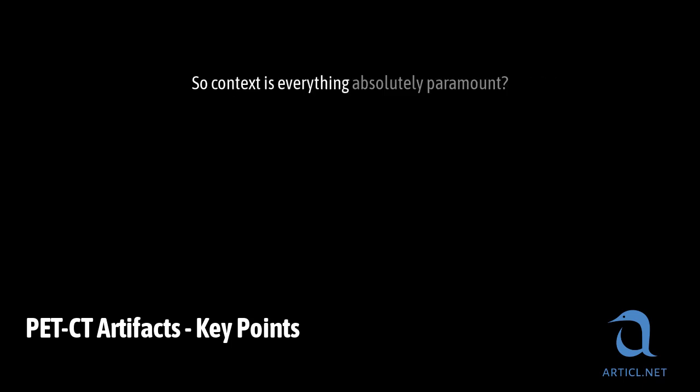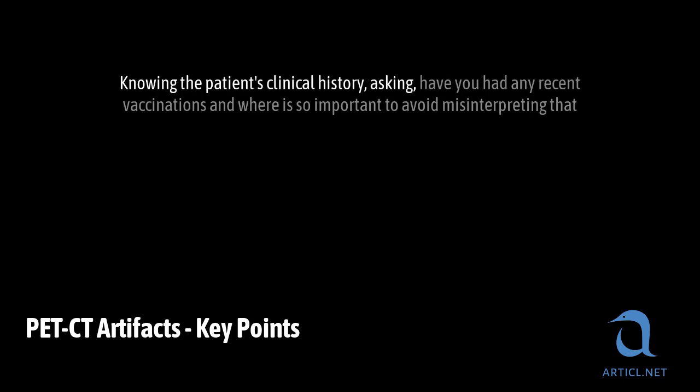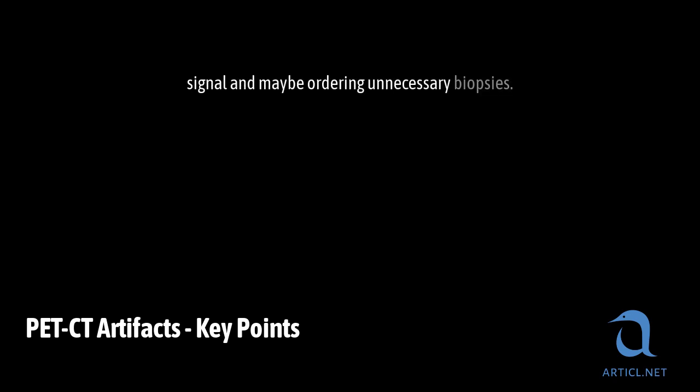So context is everything. Absolutely paramount. Knowing the patient's clinical history, asking, have you had any recent vaccinations and where, is so important to avoid misinterpreting that signal and maybe ordering unnecessary biopsies.